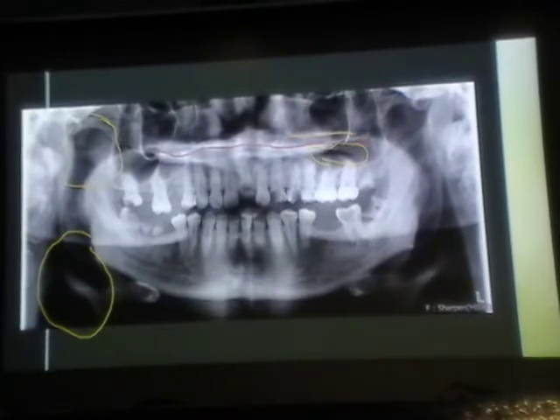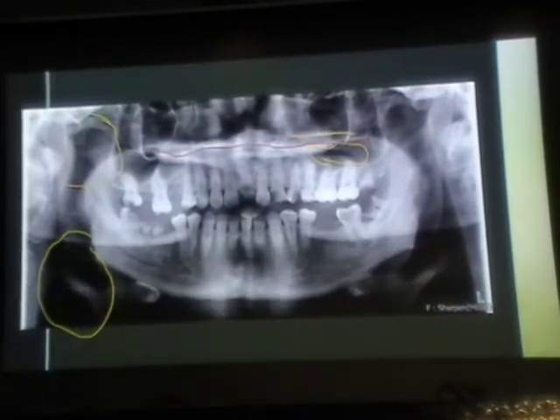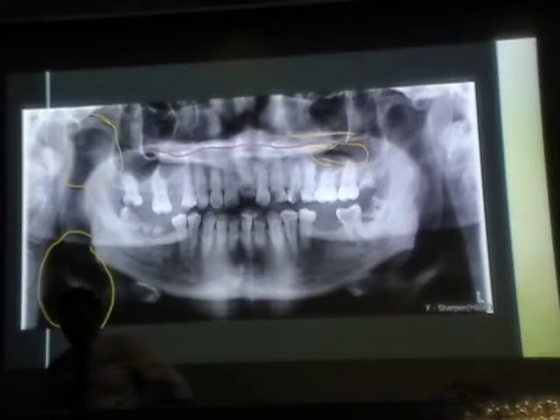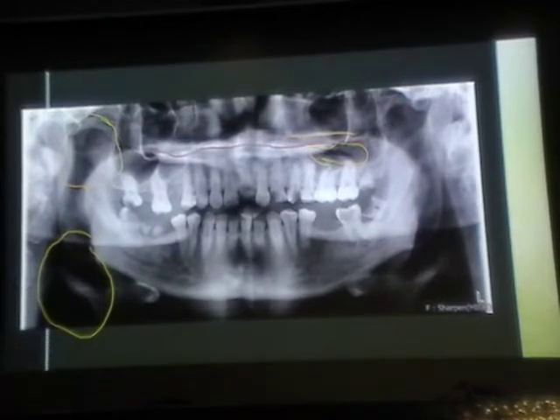Are both airspaces on the left the glossopharyngeal airspace? Like both parts that you circled? Yes. Okay, thank you. I got the top one as the nasal, the bottom as the glossal. So again, remember, depending on the question that I may ask, the soft palate will divide the two things, nasopharyngeal and oropharyngeal. So where the pointer is, that's what you have to answer on the exam. In general, I may ask, is it a glossopharyngeal or palatoglossal airspace? Something like that. I don't remember the question.